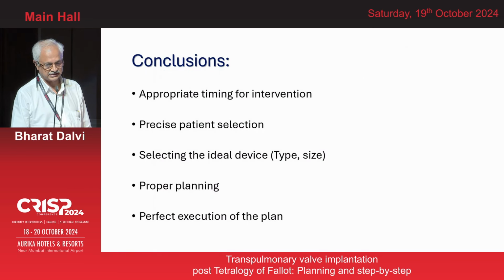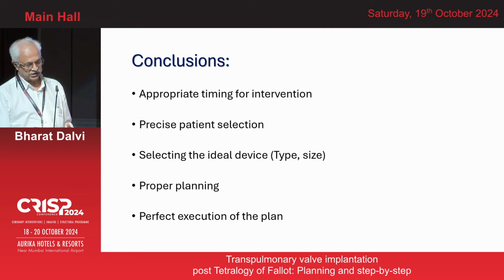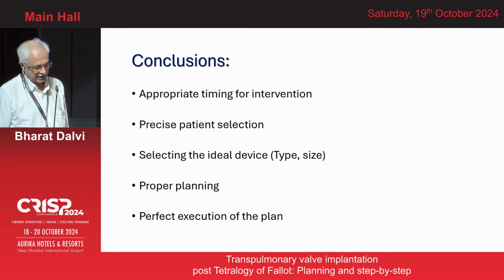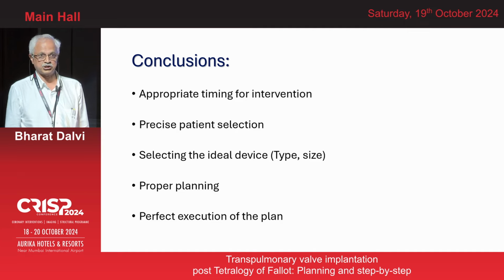So in conclusion, ladies and gentlemen, I think what is important in order to have a successful procedure is appropriate timing, precise patient selection, selecting the ideal device, the type of the valve and the size of the valve, proper planning, and perfect execution of the plan.